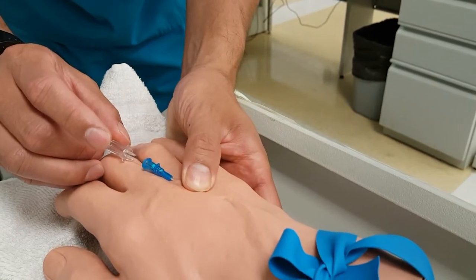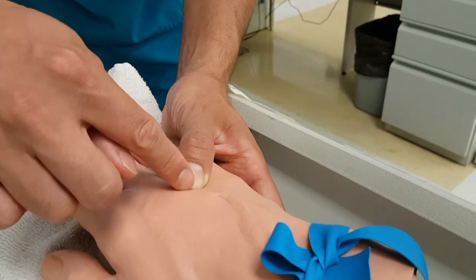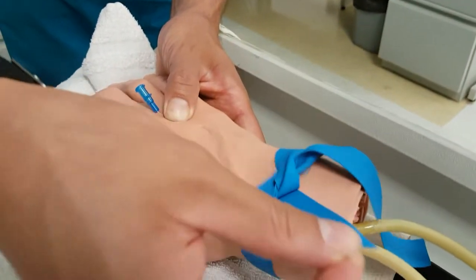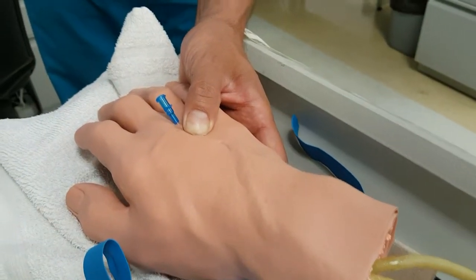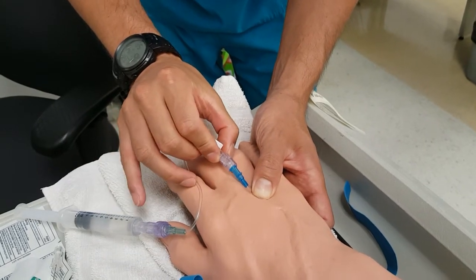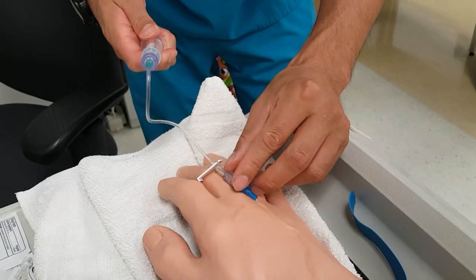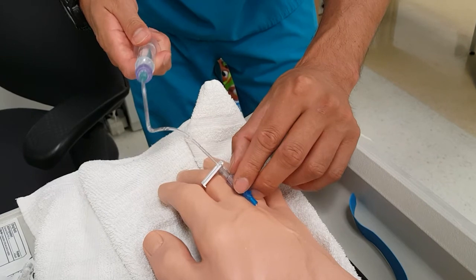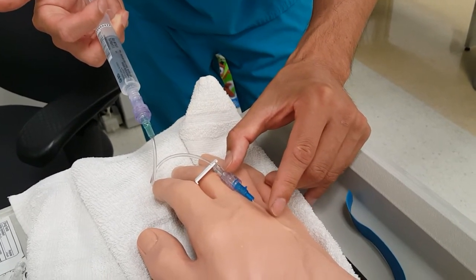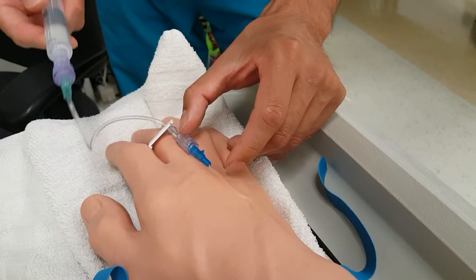You want to occlude where that catheter is, stopping blood from leaking out, and then pull out the needle. This is where most newbies have a problem — they always forget to remove the tourniquet. I'm one-handed, so I remove my tourniquet. Next, get your extension tubing, flip that cap off, and secure it. Once it's in place you can let go and start screwing it in, then pull back to see if you have any flashback. Start flushing and watch the area — look for any bubbling, redness, swelling, or the patient saying it hurts. If that's happening, it's no good; otherwise, looks good.